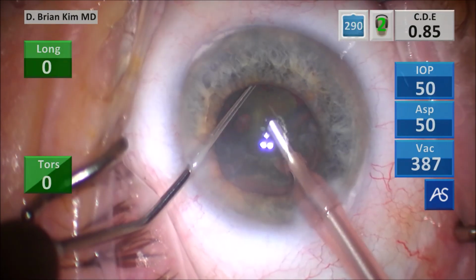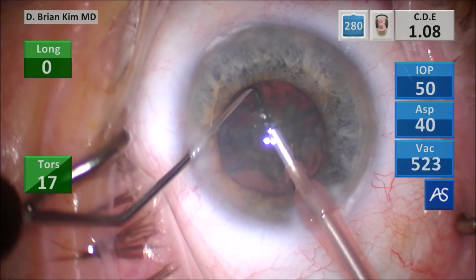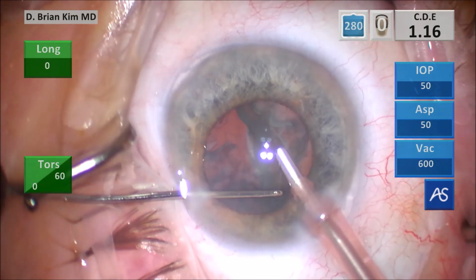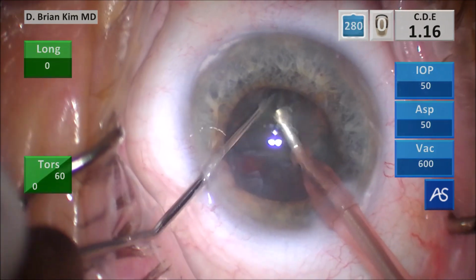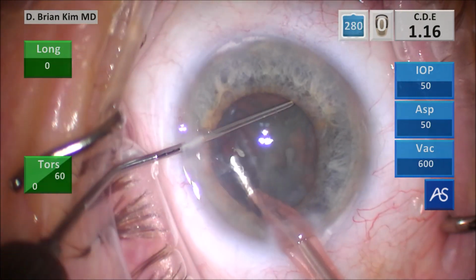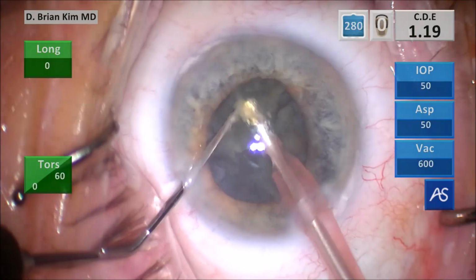Use the chopper, get around the lens piece. You're familiar with doing the technique because that's how you have to chop when we do the chopping techniques. So this is very easy. I spin the second heminucleus in front of me, place the chopper around the lens piece, divide that lens, placing the chopper around the third quadrant again, chopping that third quadrant and pulling the pieces up out of the bag and emulsifying the lens pieces.